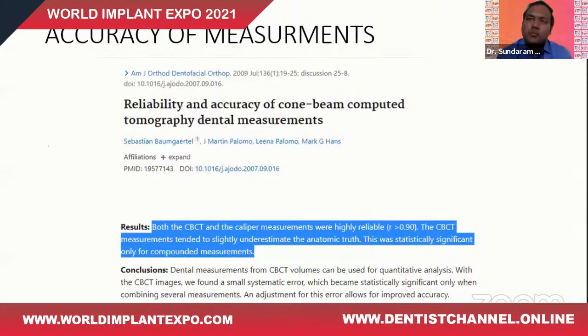The next concern we all have about CBCT is accuracy. Is it that accurate? We have n number of documentation which says that the reliability of the accuracy of CBCT is really high, and it can account for a little magnification or a little degraded value on a negligible basis. In short, it is acceptable. And these are precisely the reasons why we leave a margin of about 2 millimeters whenever there are anatomical barriers like the inferior dental canal or the maxillary sinus in the way.